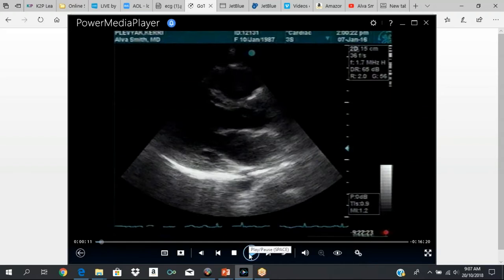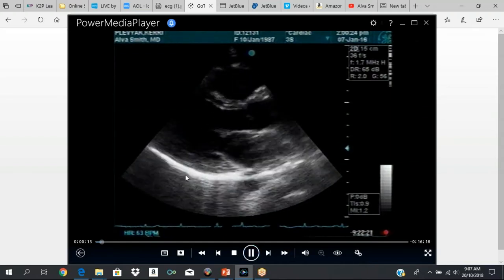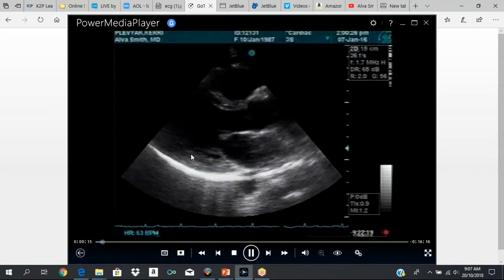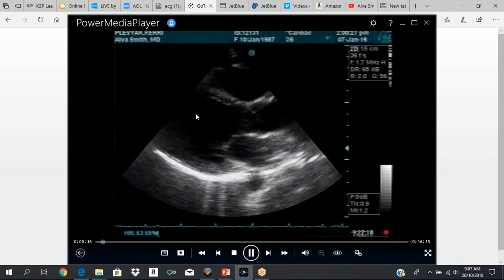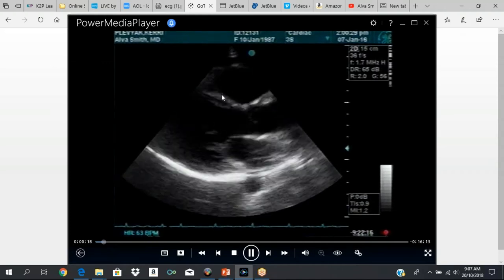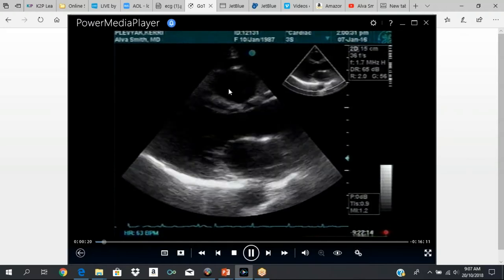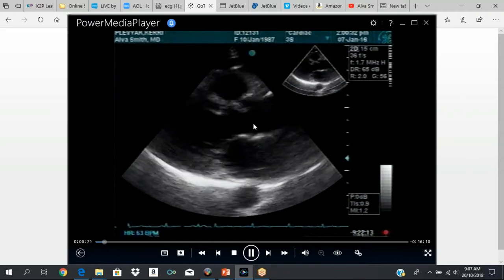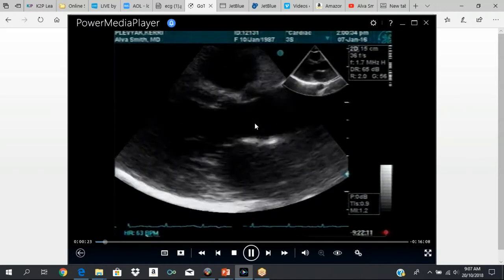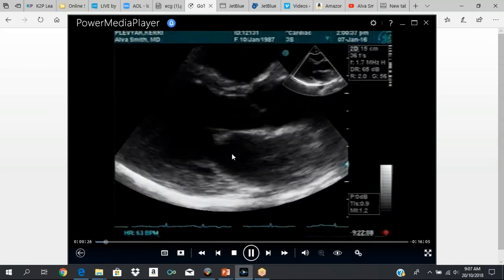Let's put it in play. Posterior wall, LV cavity, septum, right ventricle. This is the aortic valve opening and closing, and the mitral valve.